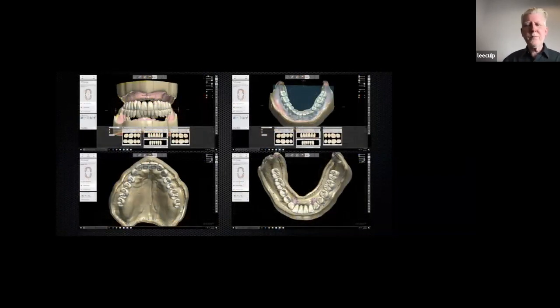Now, this is why it's kind of cool, something you may want to look at in doing digital dentures, because this is where it gets fun. The denture teeth and all the molds of most dental manufacturers are in there. We're using the Ivoclar molds here, but the denture teeth, upper and lower, are bonded together. They're one piece. So wherever I take the teeth, they go together. You know, they're locked together.